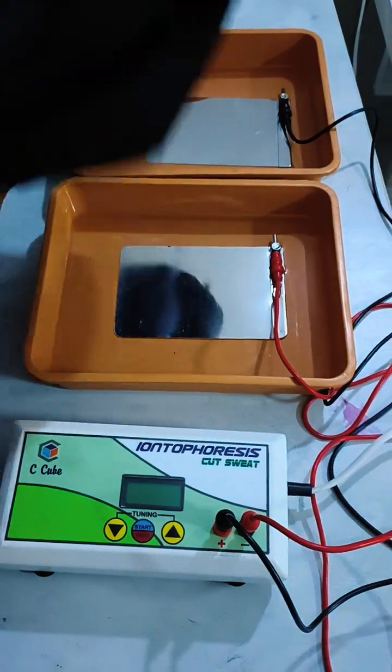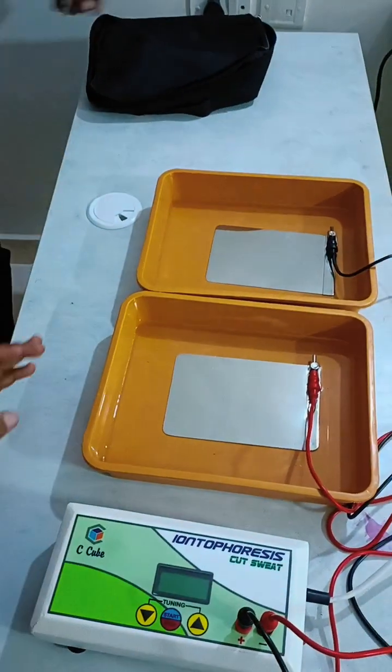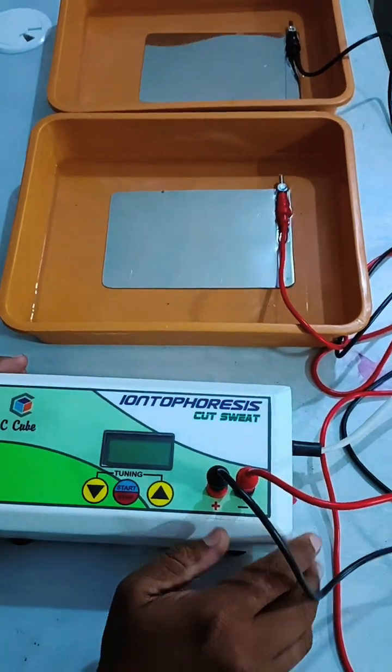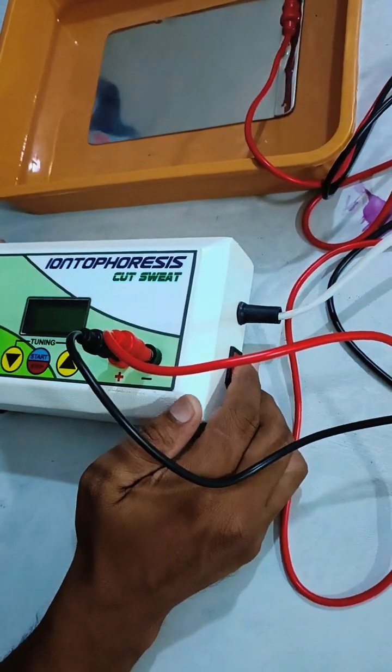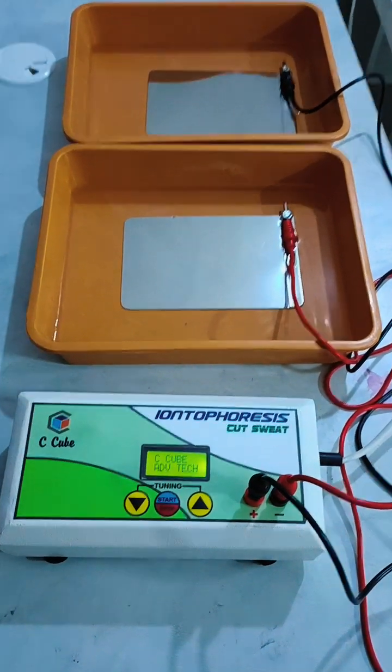This entire setup can be carried in a small bag, which is travel-friendly, and the maximum weight of the package is 1.5 kg. Connect the device to the power supply, then turn on the switch on the side of the machine. You will see the C Cube Advanced Technologies startup screen.